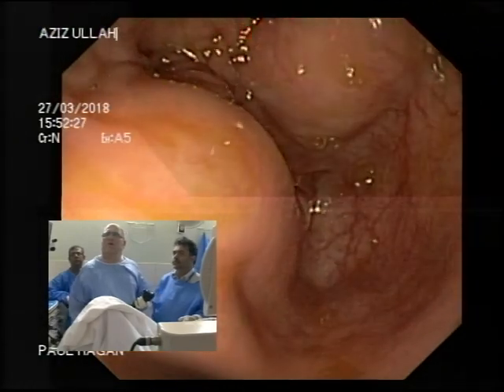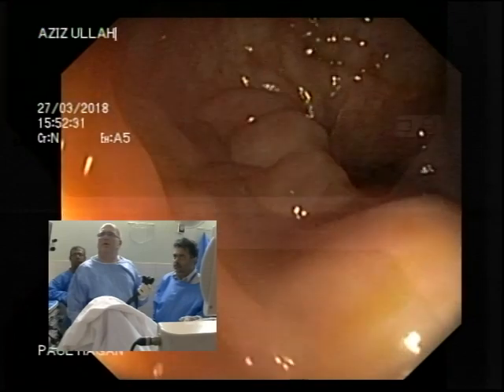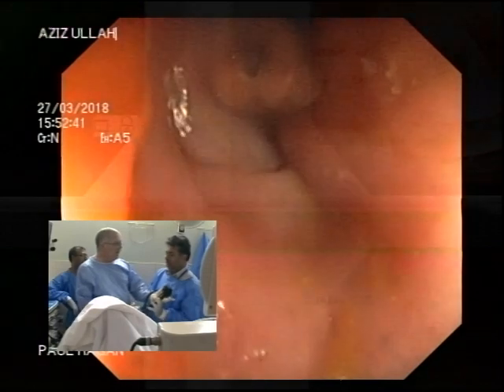Can you see how the scope has gone forward now? Let it come back. See how the scope has gone forward now? Let it come back. See how the scope is going forward? Let it come back. Look at the gel all over my hand.